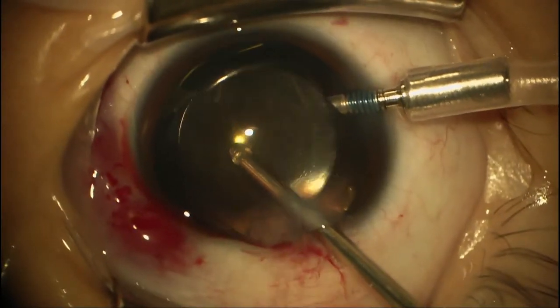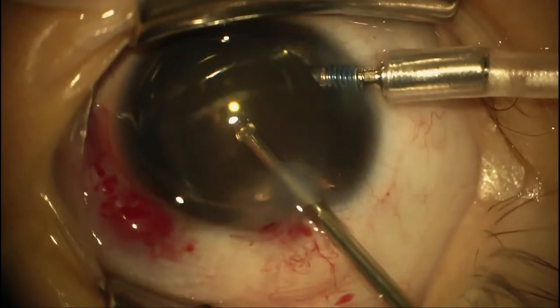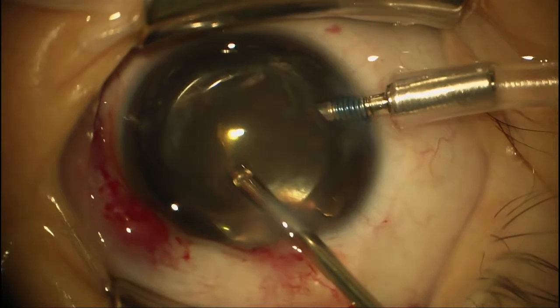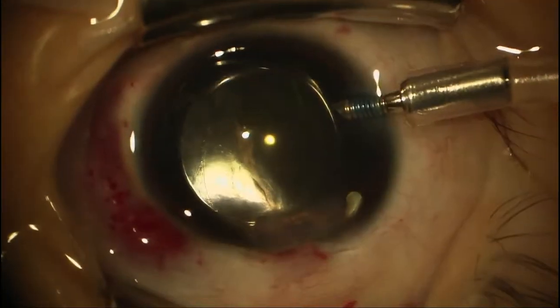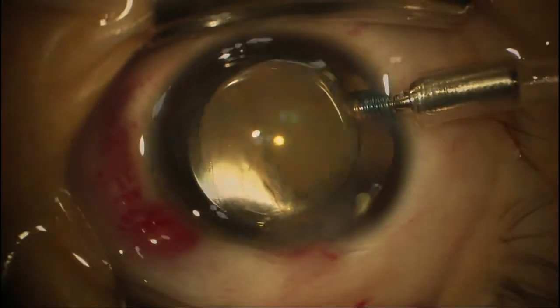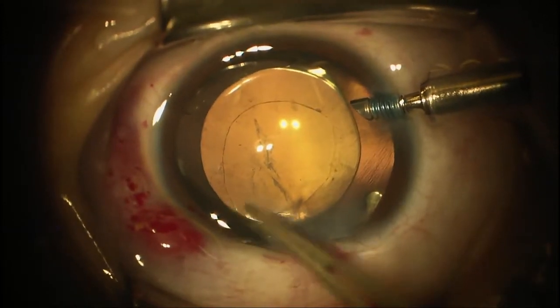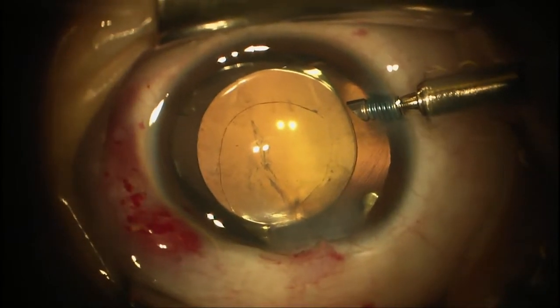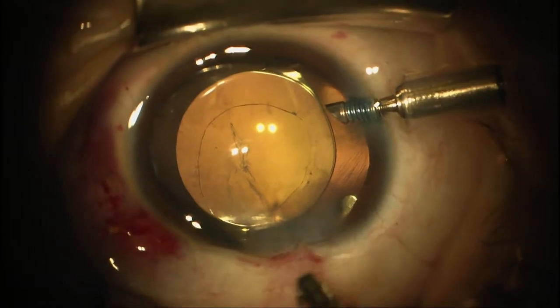I'm trying to hold the lens back a little bit while I aspirate this viscoelastic. Sometimes the viscoelastic will plug the vitrectomy piece, so we may have to check if it's plugged. It looks like we've got some viscoelastic in the vitrector, so we're going to flush it out. You can see the capsulotomy goes around — it's just kind of egg-shaped right there — but we don't have any running edge, so we're in good shape. We just still want to be careful with it.